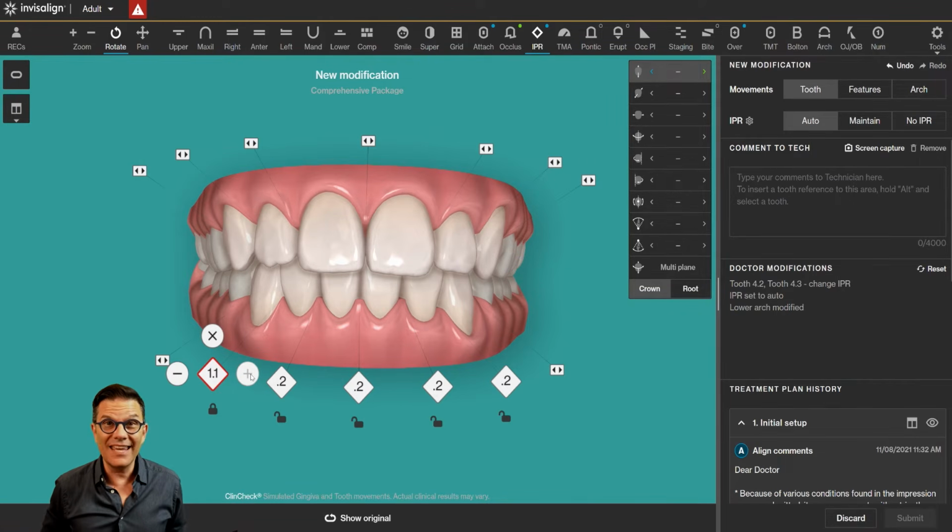I'm just saying in some cases, maybe there's a big filling there that you want to remove that is misshapen. Maybe the width of the two centrals are completely different. One is completely misshapen compared to the other. So it can happen that you want to remove more than 0.5.